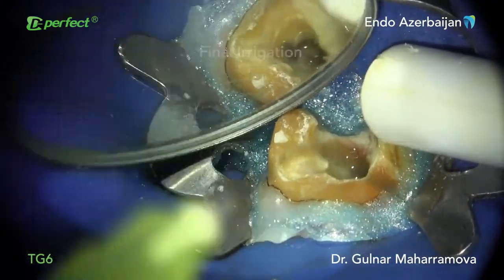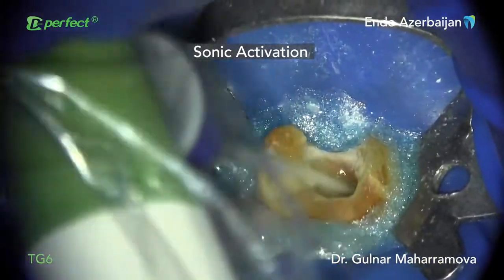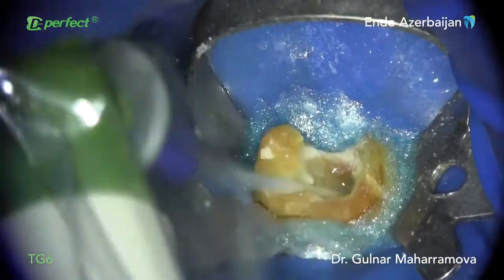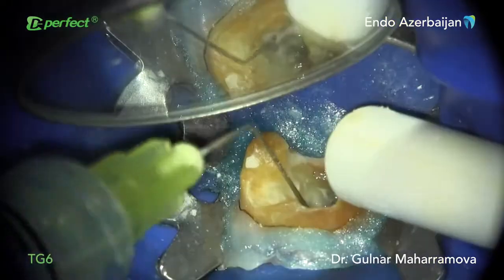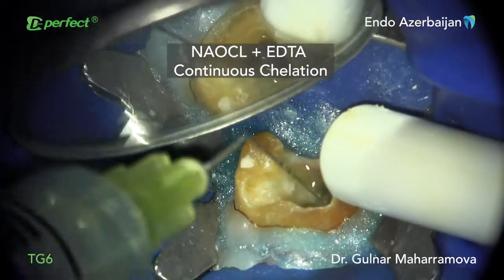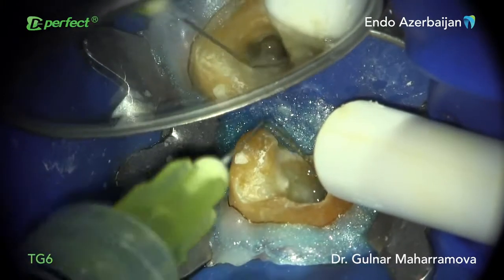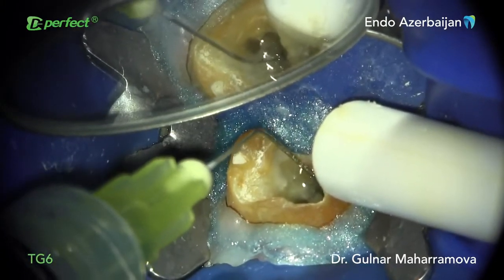To obtain better cleaning, I used sonic activation during the final irrigation. Moreover, the principle of continuous chelation by mixing 5.25% sodium hypochlorite and 17% EDTA solution was applied to get effective disinfection of the complex anatomy.